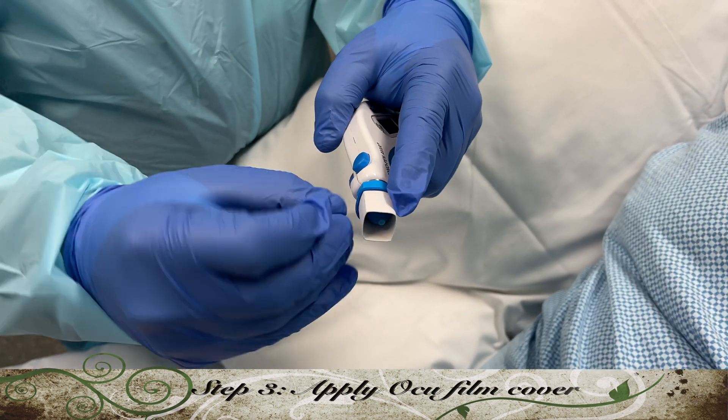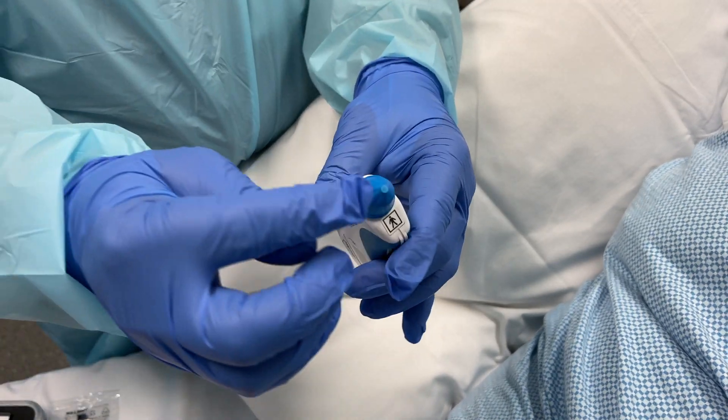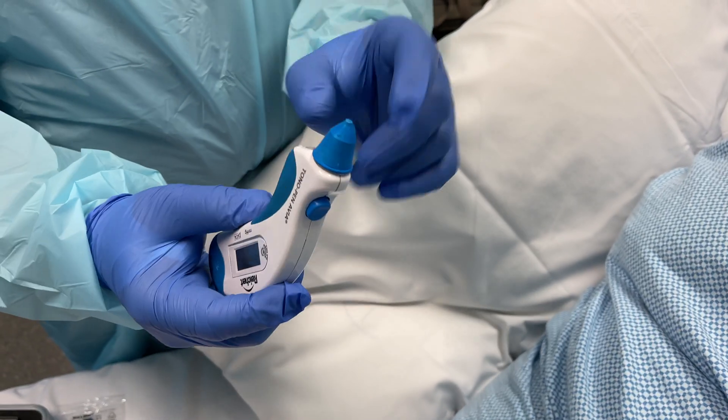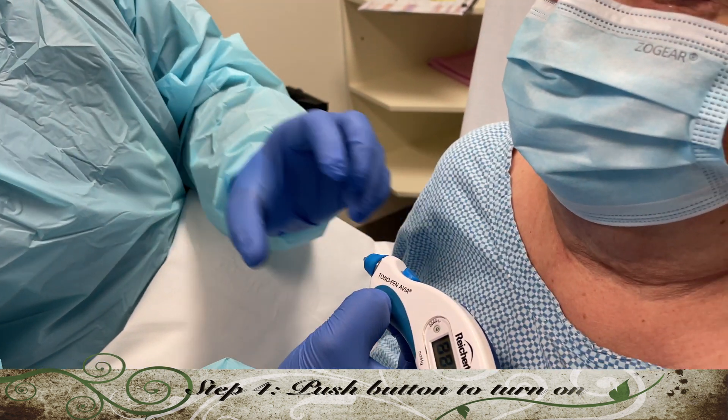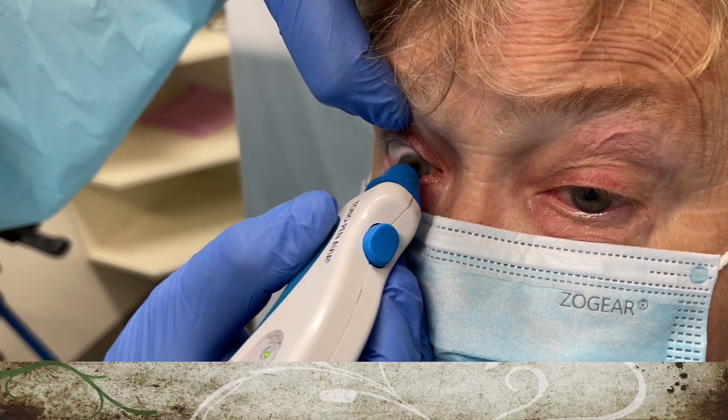Now we apply the Occufilm cover without contaminating the tip. Just turn the tonometer pen on by clicking on the small blue button just once. When it beeps and gives you two lines, you're ready to test.